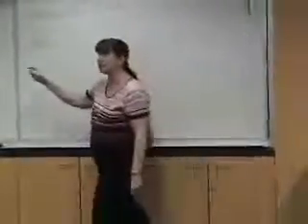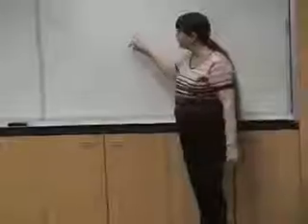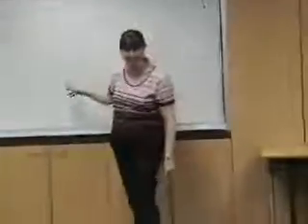All right? The testing only involves giving one sub-Q injection to Mr. or Mrs. Pillow, which you have in front of you. That's your patient for today. So we're going to practice using the calculations, the formula, so you know how to do that in case you haven't practiced that in a while.